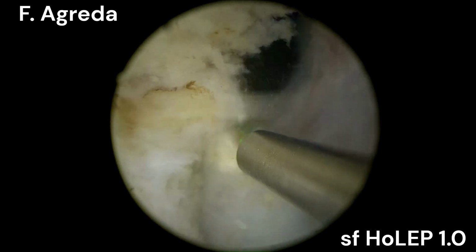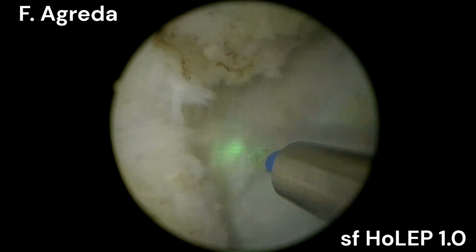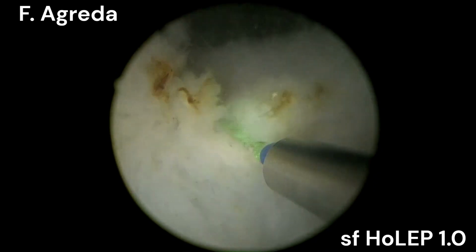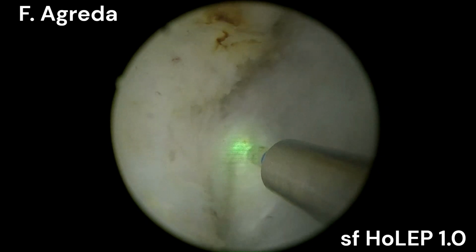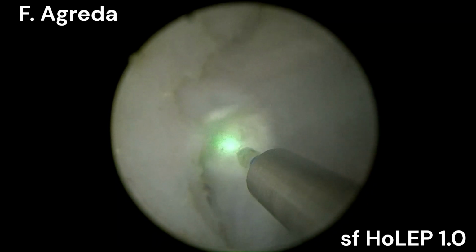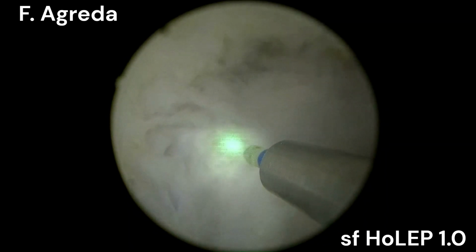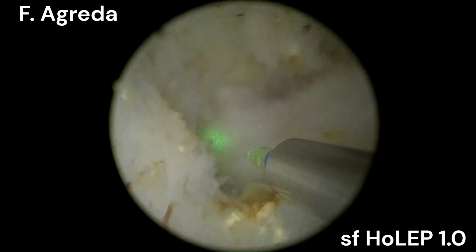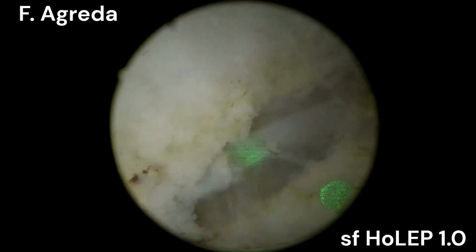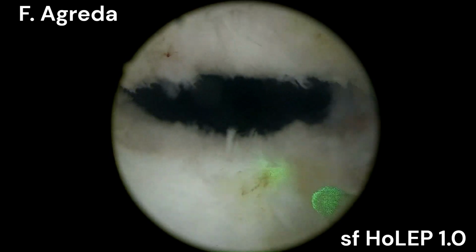So as you see here, I'm approaching this adenoma from the left side, and I'm trying to leave some protection in this bladder and this prostate capsule, as it's very thin here. Besides this portion of capsule I'm trying to leave with the patient, I'm trying to move the adenoma to the left and place my endoscope in between this, let's say, leaf of capsule here. As you can see, this part of capsule protects this very thin part of capsule about to get a perforation.